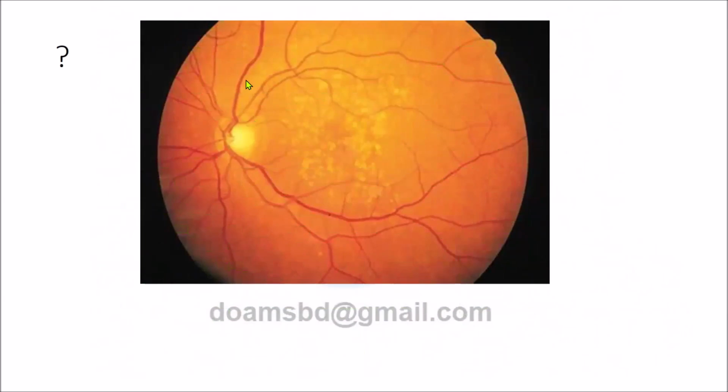Now a quiz question for you. What are you looking at there, doctor? Please respond. It's normal. No, sorry, if there are drusen, it's a sign of maculopathy. Maculopathy, but not retinopathy. Okay, if you say that the macula is a part of the retina, then it is a retinopathy. But other than the macula, is there any damage to the vessels? We already described the appearance of the normal retina. So any changes in the vessels here? No changes. Changes in the optic disc? No changes, sir.